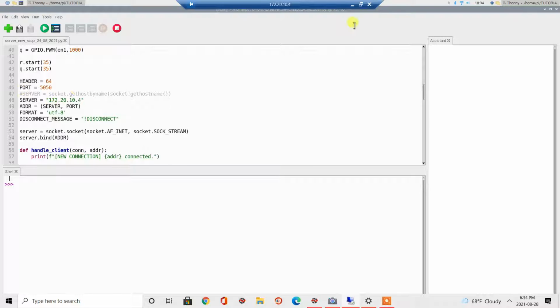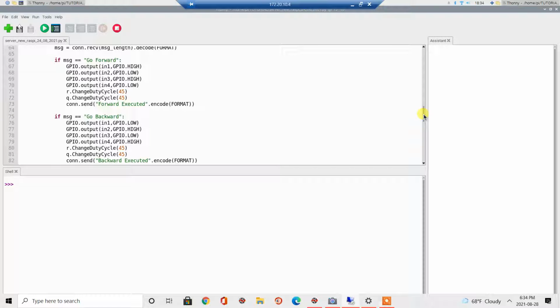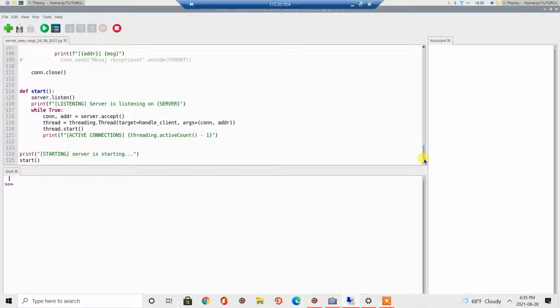This is the sequence of code for enabling the WebSockets-based wireless communication. Then I added some if instructions for switching between movement directions: go forward, go backward, turn left and turn right. Also, the stop command was implemented. At the end of the program, a function was defined for listening for new clients or new threads. The Raspberry Pi plays the role of the server, while my computer has the role of client. I will run this program, so it will be listening for new clients.